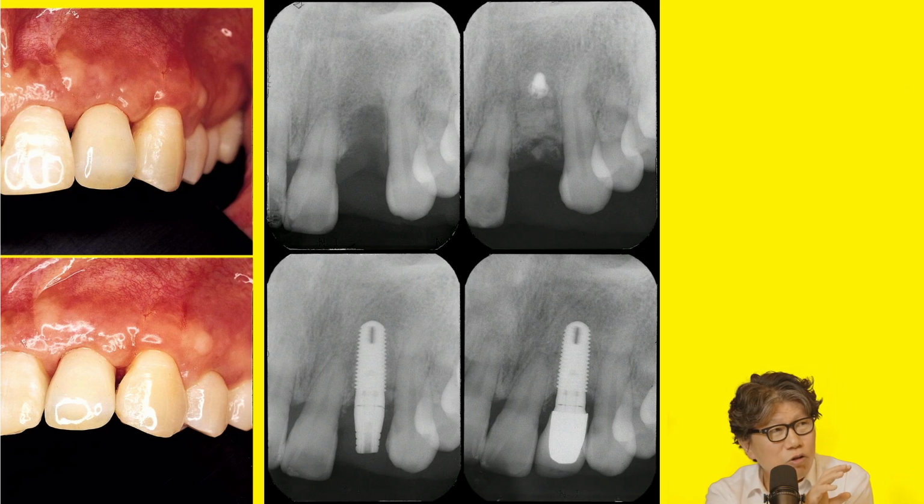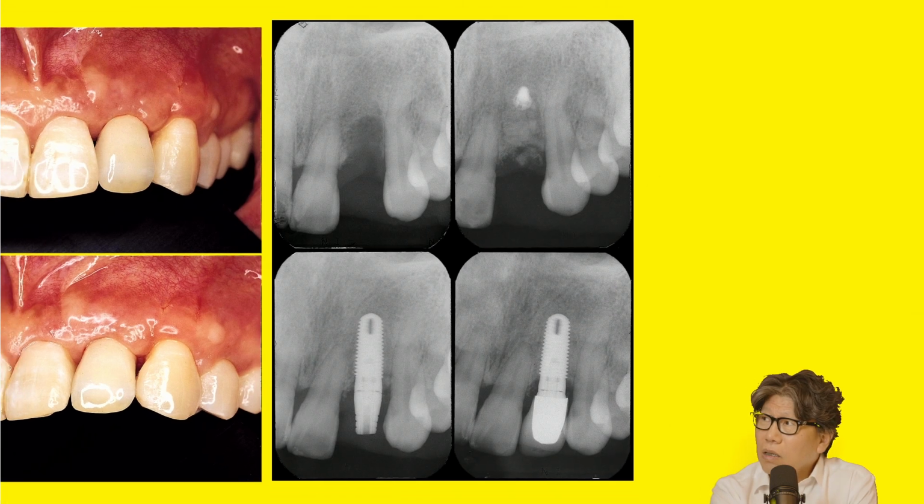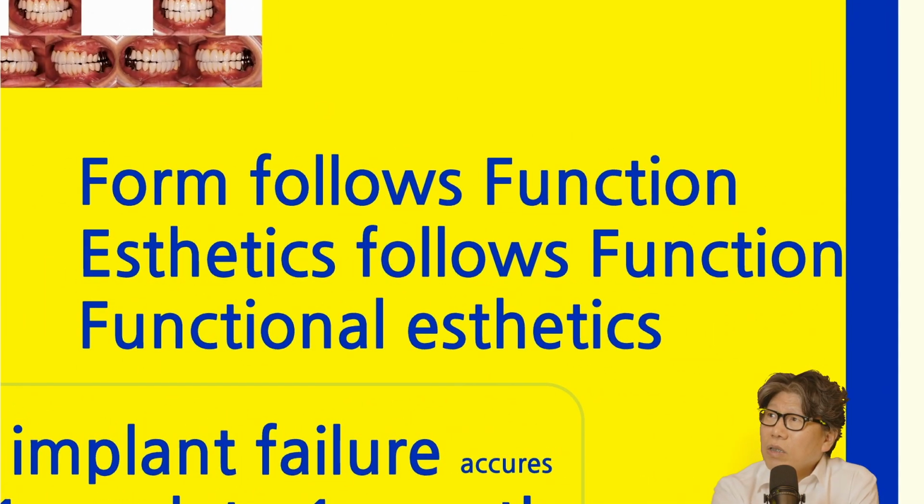I mean, if you can preserve the bone around the implant, it's aesthetic. And it's all about aesthetics, and it's all about placing the fixture in a good location and in a good orientation. We say a lot of things, but at the end of the day, we say form follows function. Literally, form follows function. Aesthetic eventually follows function. So it's a functional aesthetic.